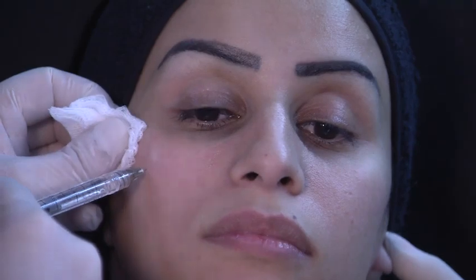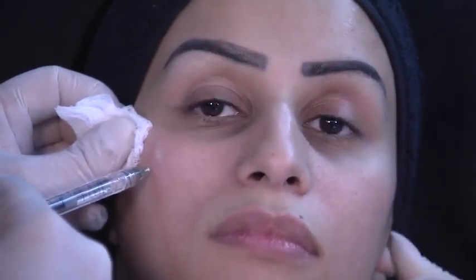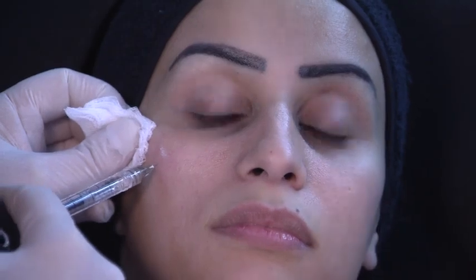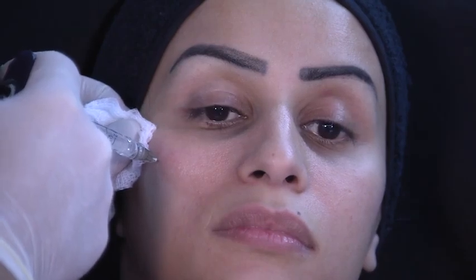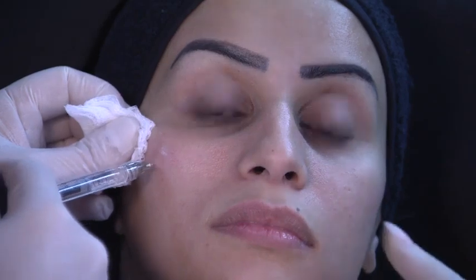Very slowly, I will add a little bit more than in the first point, which is 0.3. Now remember, look at my angle of infiltration. My syringe is pointing upwards. If I point downwards, all my product will go down there, and I don't want that. I want to project and to lift a little bit the skin, create a new shape. So that's our second point.